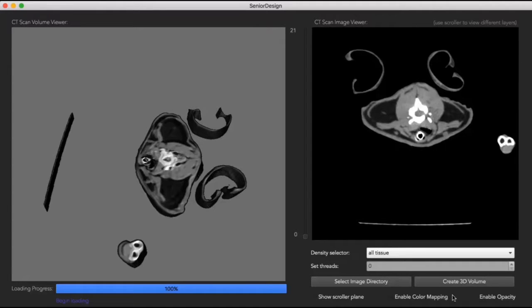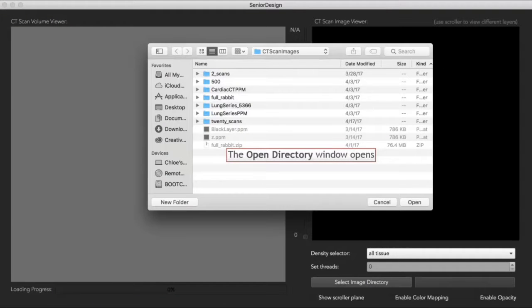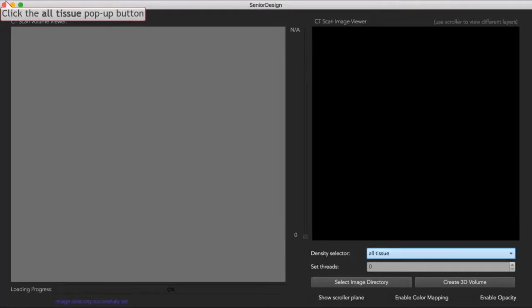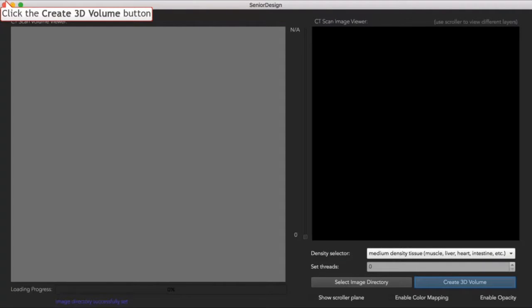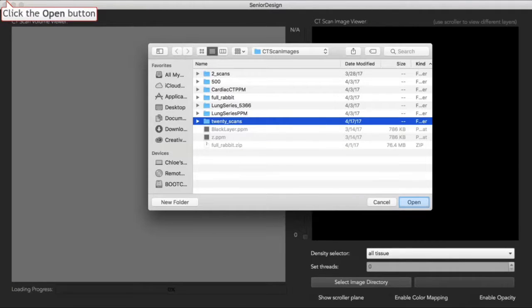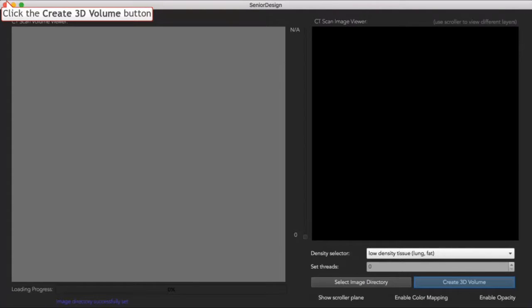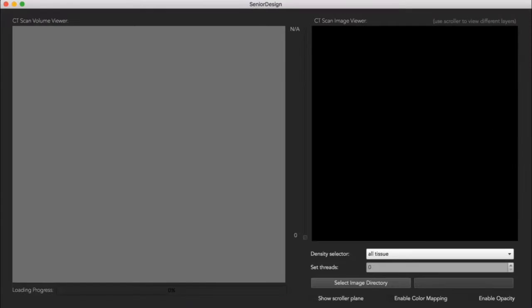You can see on screen 20 layers of a rabbit chest CT scan. I am showing here the various densities that can be shown. I can either show all tissue densities, the first that you just saw, medium densities, which would be muscle, lung, other organ tissue, and low density, which would be stuff like fat and air.